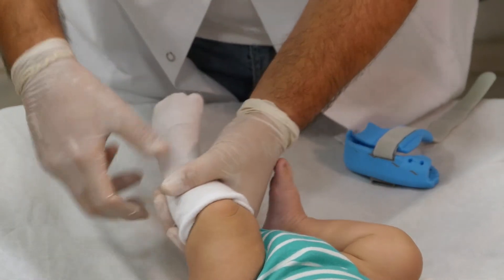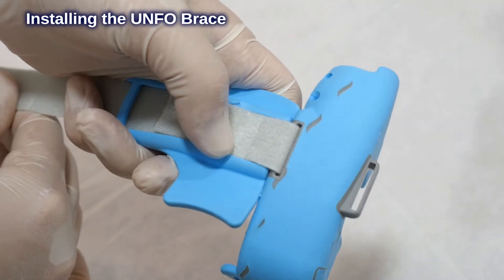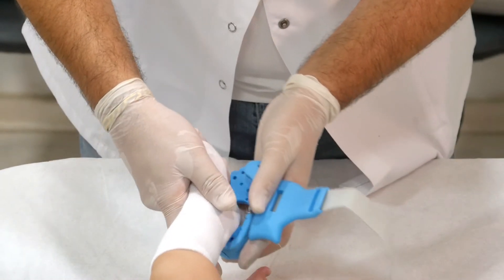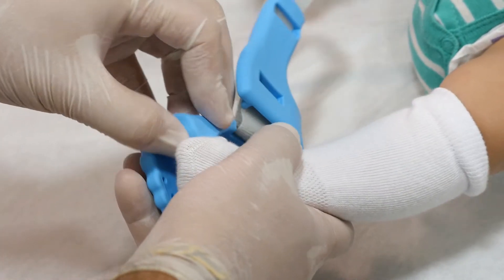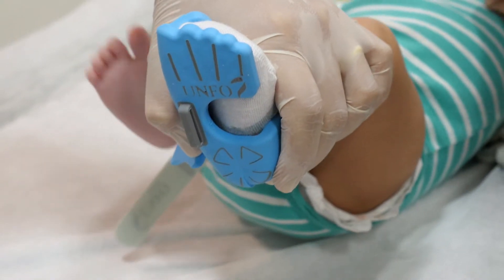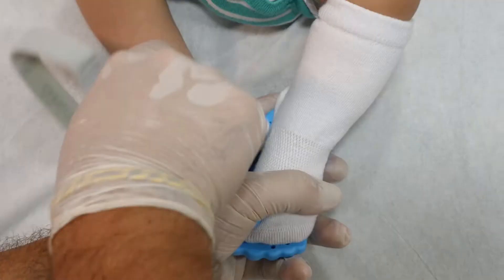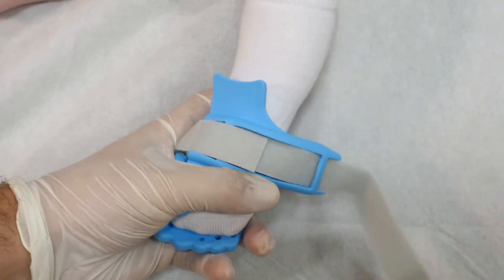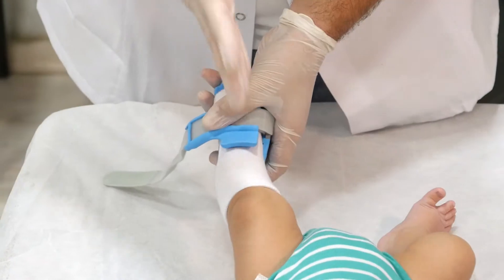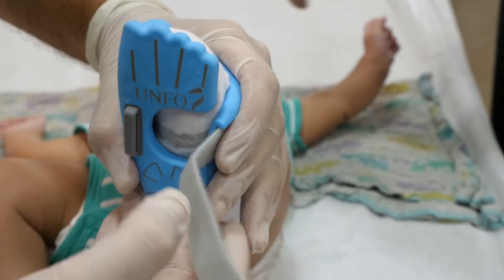Folds might cause redness around their area. Before the setup, place the cushion as close as possible to the brace's body. After bringing the cushion and brace's body together, hold the foot and place the heel in its position directly. Hold up the toe fastener and insert the rest of the foot. Make sure the heel and the end of the brace have tight contact, so the whole foot tightly touches the bottom of the brace. After inserting the foot, adjust the cushion so it is in the center of the foot, aligned with the middle of the shin. Embrace the foot and cushion together tightly, and avoid any void between the foot and the cushion.